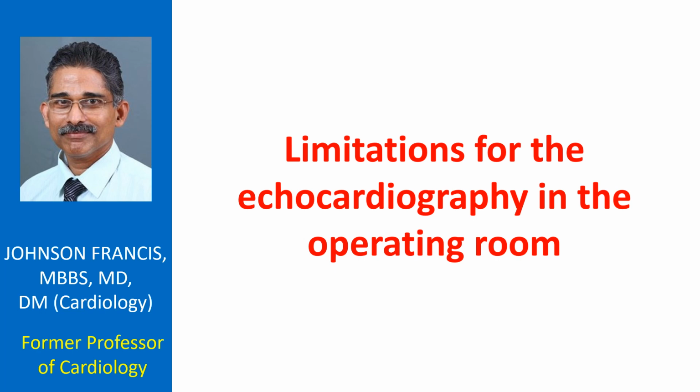Limitations for echocardiography in the operating room. Lighting and space for the machine may be suboptimal in the operating room. Electrocautery may interfere with the echo signals.